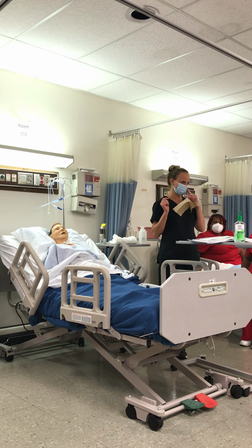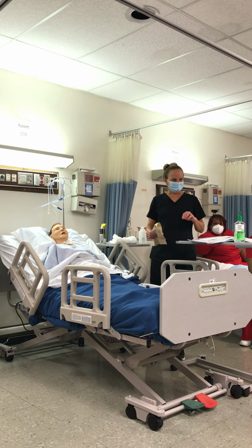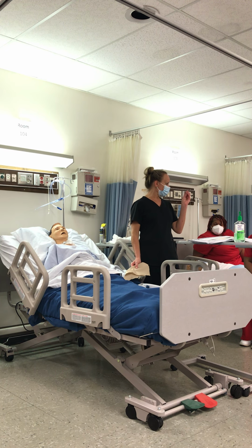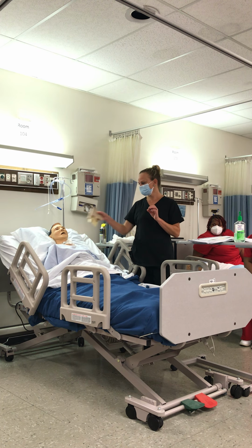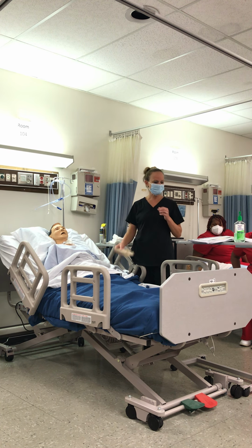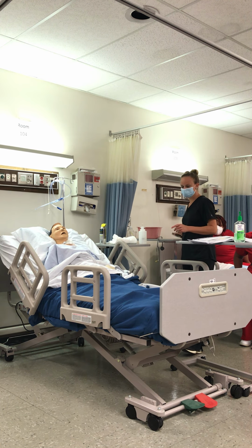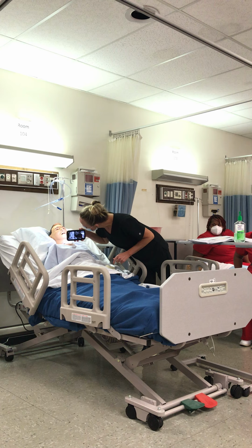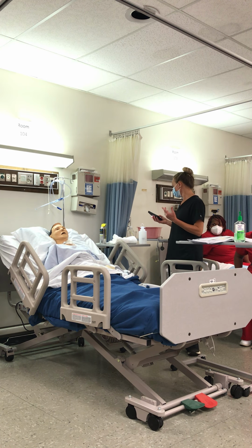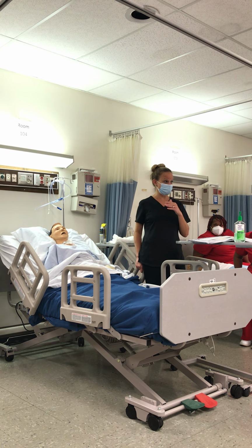When you blow your nose, if you blow air out of this side, then you blow air out of this side, you're making sure that you have a good passage, because it's going to make more noise if there's a more narrow passage, right? So that's something you'll be assessing for. The patient can hold the tissue; you don't have to hold it. Let them blow into that and then determine which nare would be best. Getting a light. I do not have a flashlight. If somebody has a penlight, you're welcome to give it to me. But looking into the nose, you can literally see polyps, cysts, or growths in there, and you would not want to go that direction.